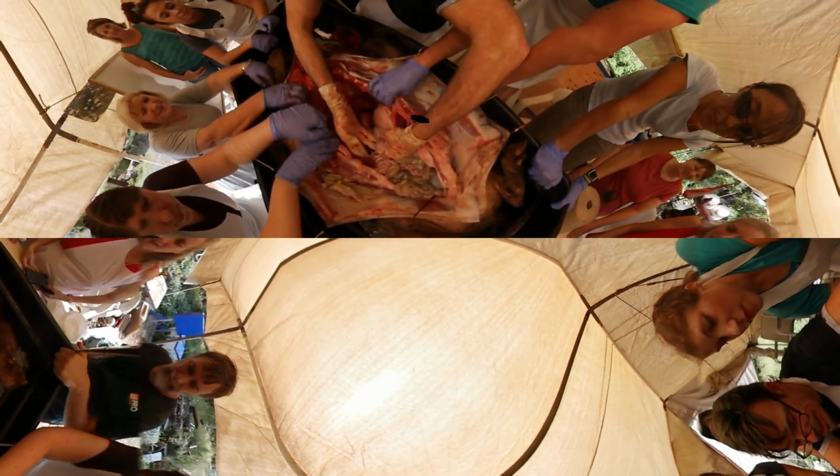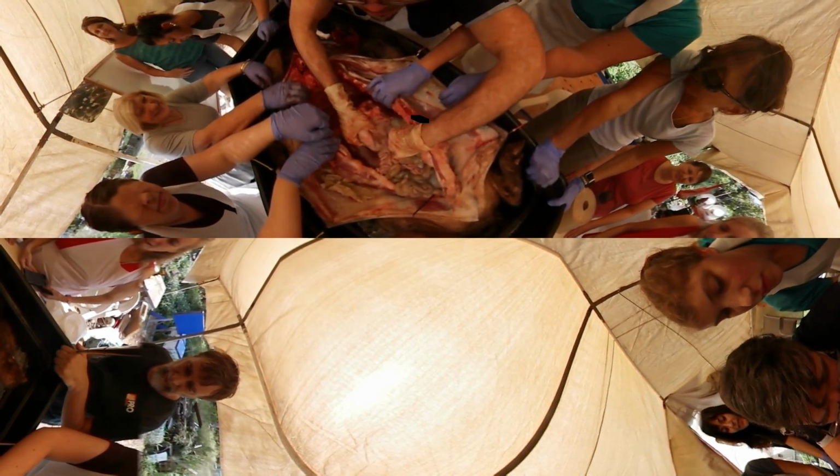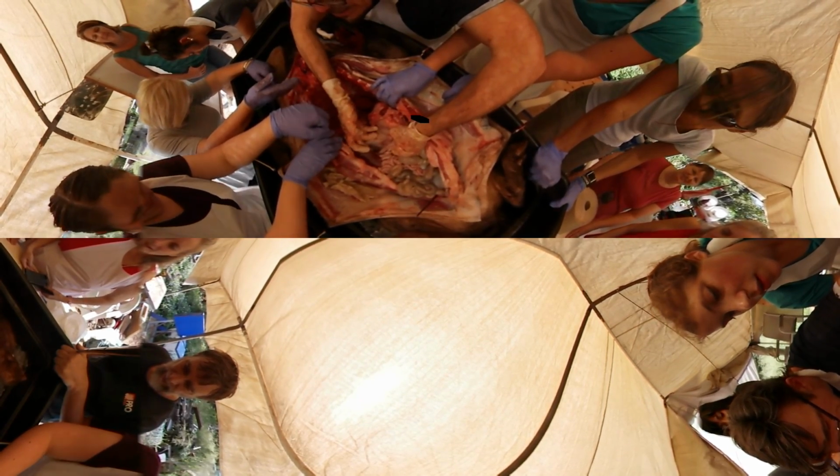Okay, we're moving right along here. Can you see your pancreas? It's a big stomach. Is that all stomach? Where is that? I can't see the pancreas. The pancreas is tucked in behind.